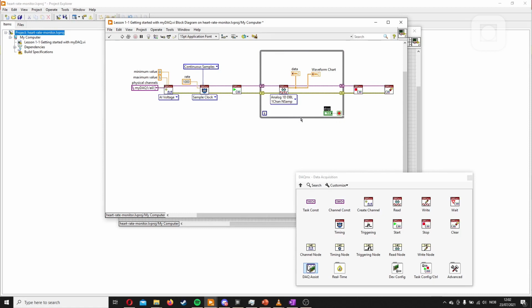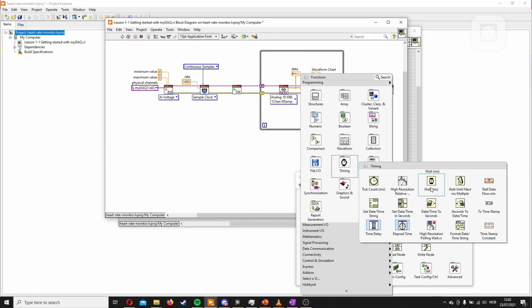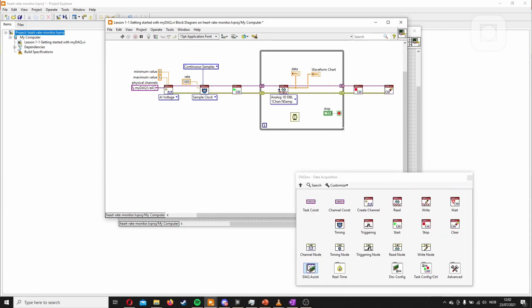In any while loop, it's good practice to just add some timing here. So this will not affect the reading as it goes on its internal clock. So you have to worry about that for other stuff. But for now, this will only give out data once it's ready. And instead of asking it all the time, do you have the data? Do you have the data? We'll just ask every 200 milliseconds.